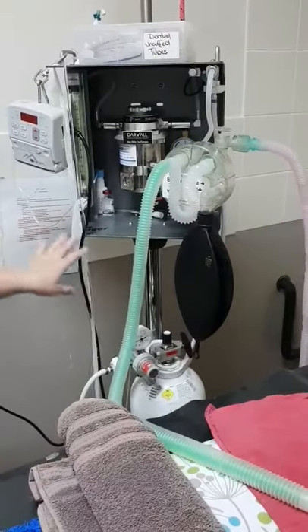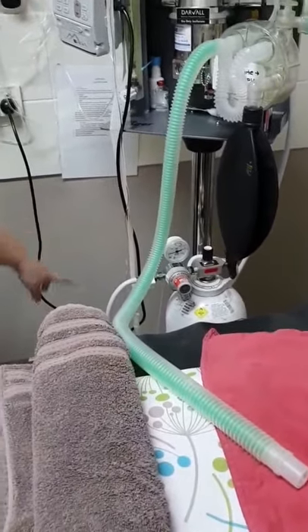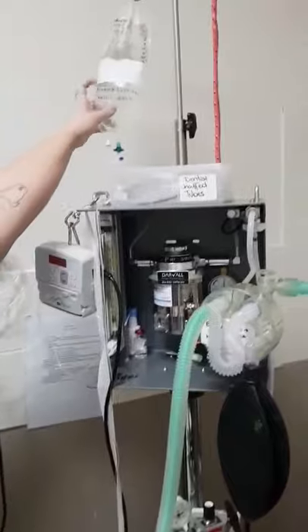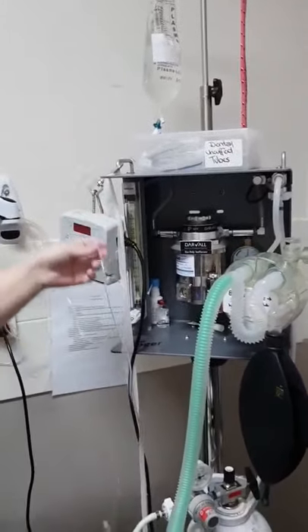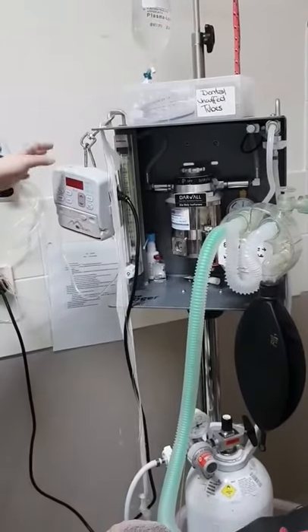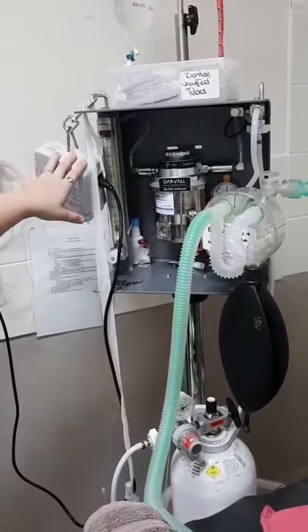To turn on, we make sure the oxygen is turned on in the morning. We also weigh our scavenger. We then also set up our fluids, making sure that our fluid bag is in date. We will then prime the line and turn on our machine when the dental is starting.